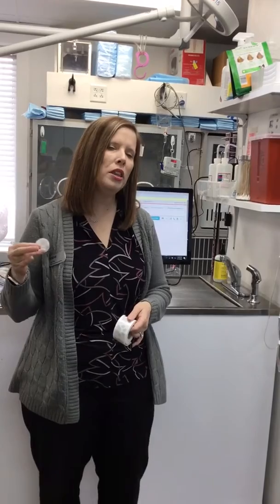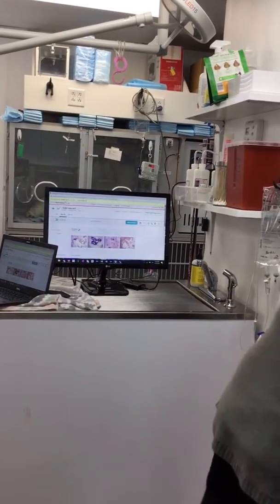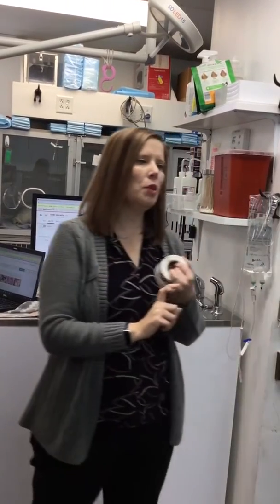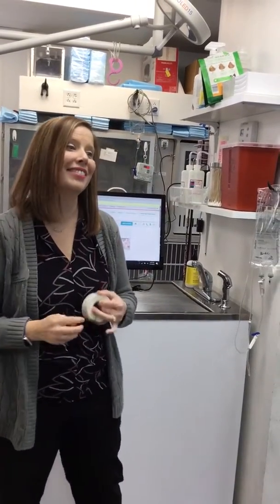Is whole blood the only thing you can run on the pro side? Yes or no? No. But can't you run plasma or serum? Can you run different solutions from the body through the pro side besides blood? I would say yeah, because you can. Yes. So you can do abdominal, thoracic, and synovial fluid. OMG, drop the mic. Yes.